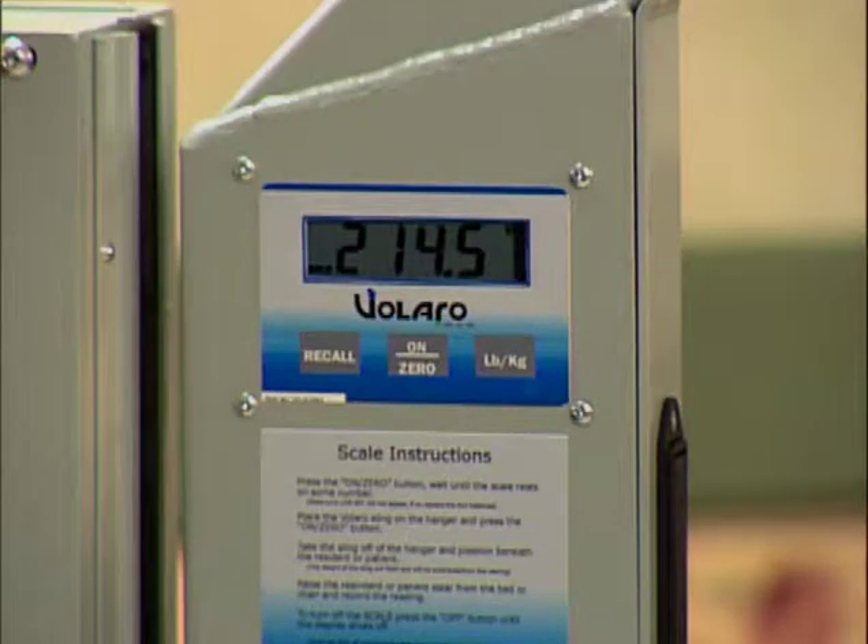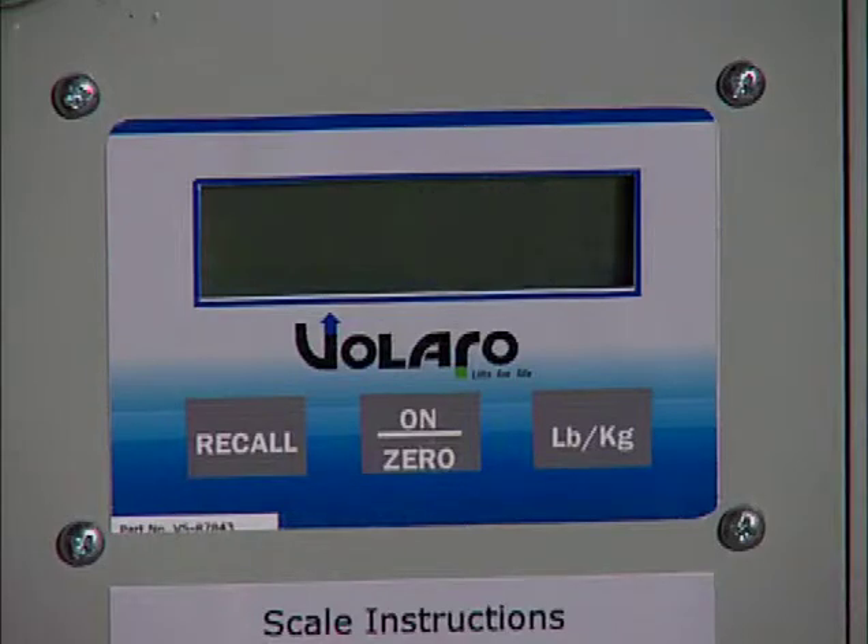Once this is done, you may view the person's weight on the display. The scale will automatically turn off after two minutes without motion. If this occurs, do not worry. Simply press and release the On Zero button and then the Recall button, which will display the last recorded weight.